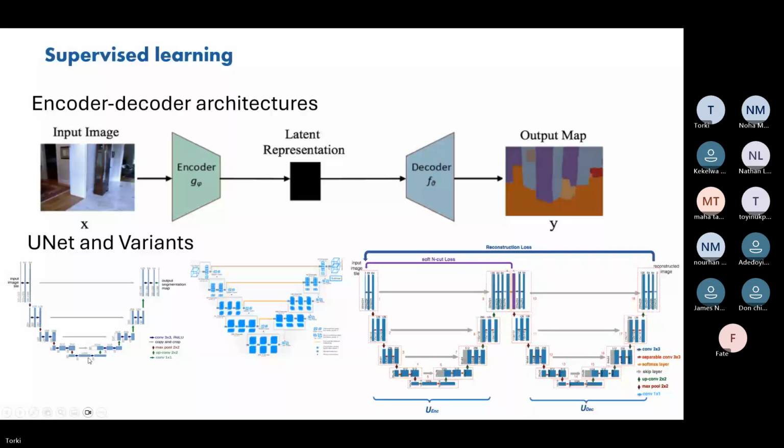And then the decoder steps are going exactly the reverse order from this latent representation to a larger representation, to a larger representation, to be equal to the same size of the input, but they are predicting the output segmentation map. Very similar to this idea, and why they call it UNet?